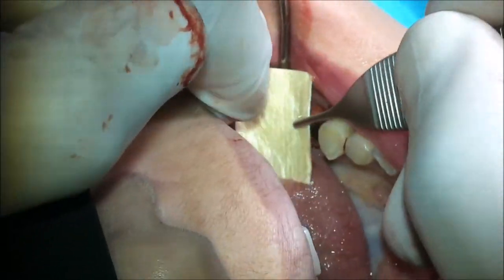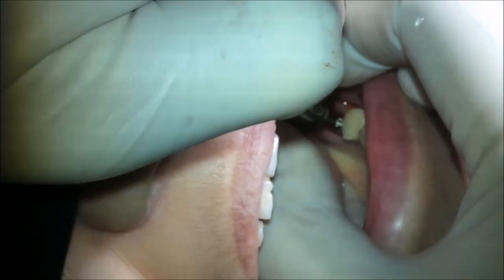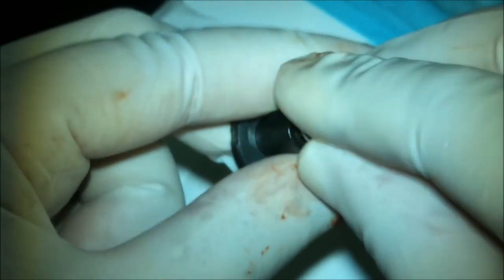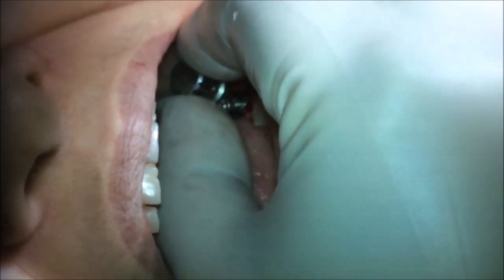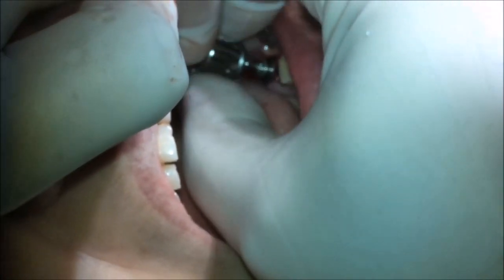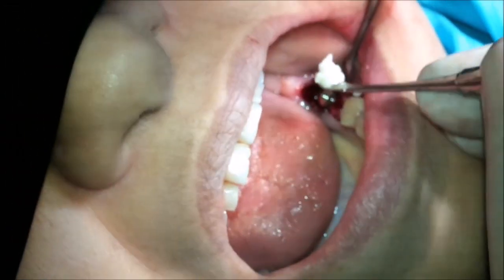Sometimes we need to soften the membrane. Then, after we put the cover screw, to fix the membrane in place, we can use either a bone tack or bone screw, or simply we can use the rubber dam punch to make a hole in the membrane corresponding to the cover screw area.